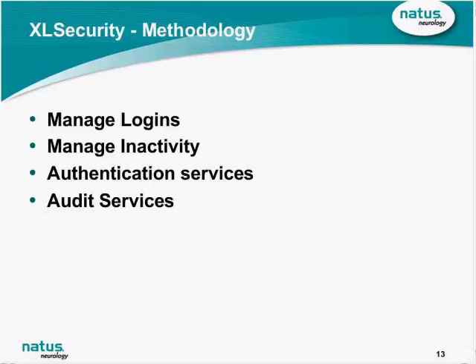The fourth method that is employed is the use of auditing services. When we talk about auditing services, this is basically tracking the user's interaction with a machine and recording the key functions performed by the user in a log file that we call an audit log. You can also call it a transaction log.